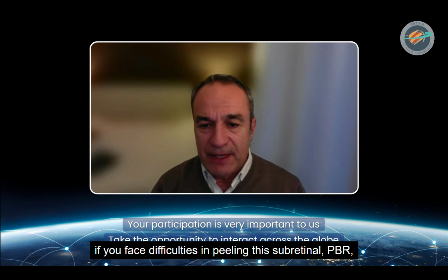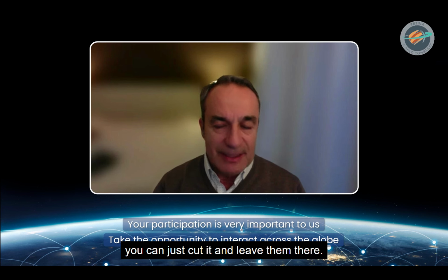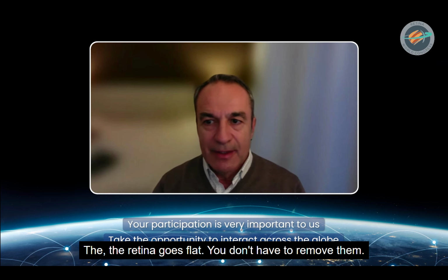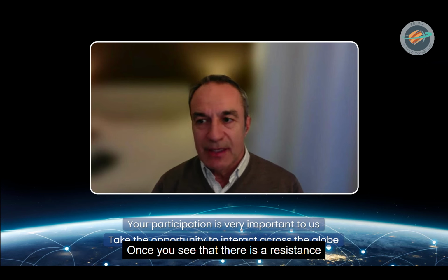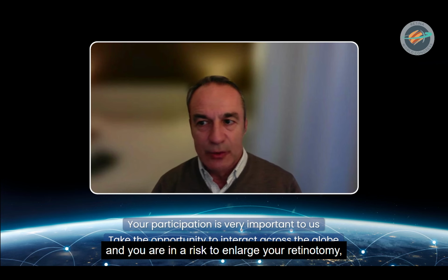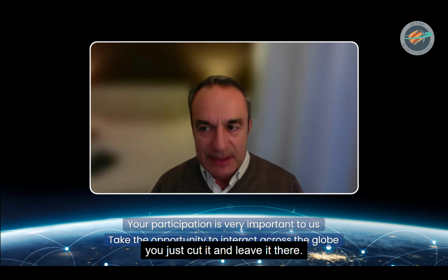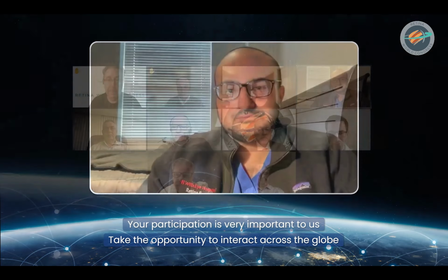If you face difficulties in peeling this subretinal PVR, you can just cut it and leave it there. Just relax the traction and leave it there. The retina goes flat. You don't have to remove them. Once you see that there is a resistance and you are at risk of enlarging your retinotomy, you just cut it and leave it there. You don't have to remove it.